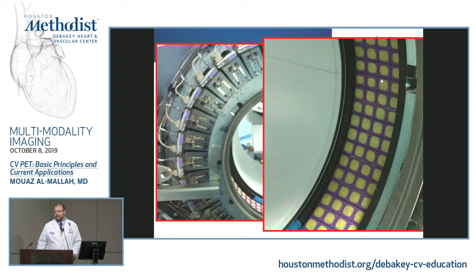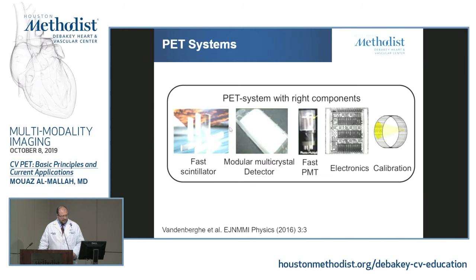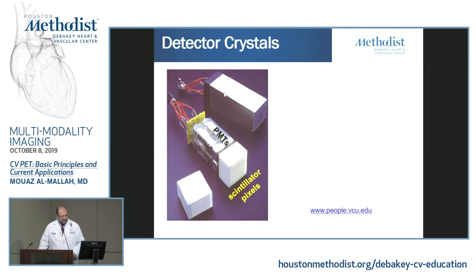And so, for example, sometimes if you're doing QC and the machine fails, they will tell you that ring number two and detector box number this is failing and you need to go back and replace it. So all the service people will do, they're going to come, take it out, and put a new one in. So how does it look when they take it out? So when they take it out, this is how it is.